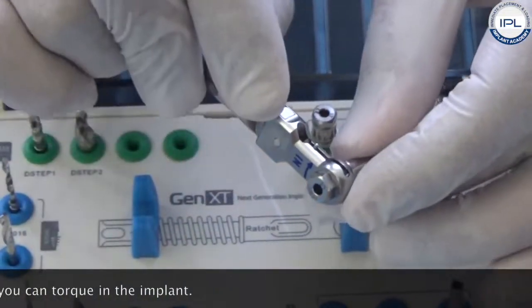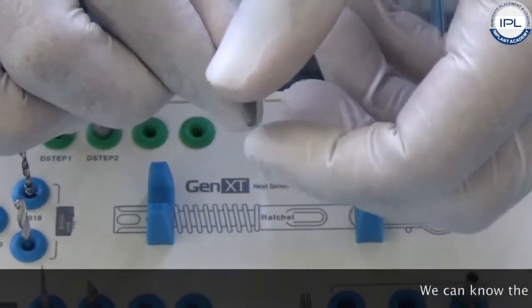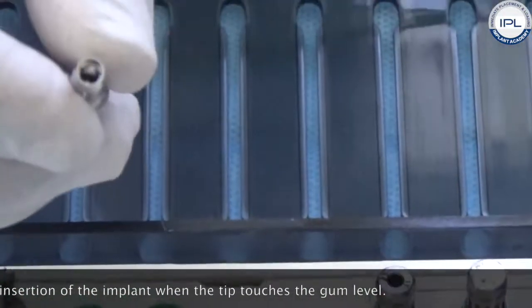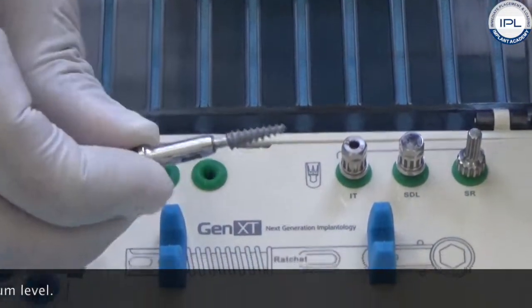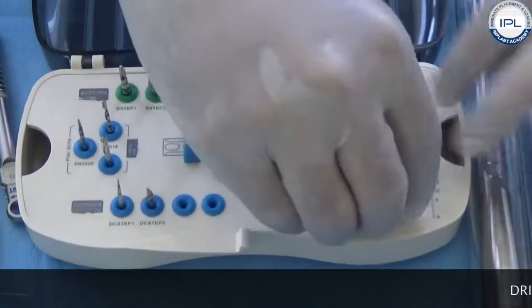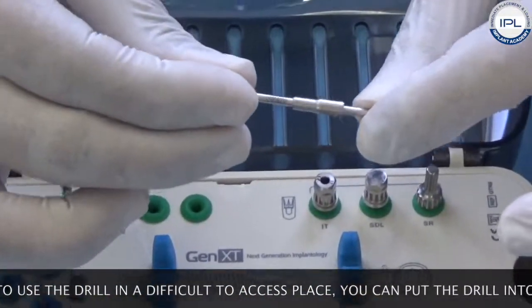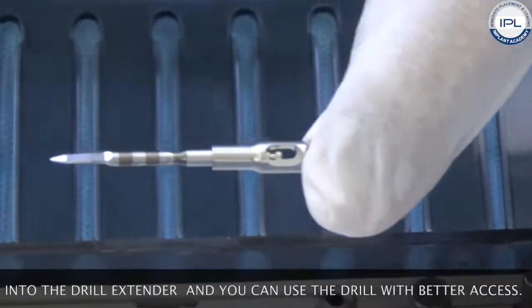A helpful guide for knowing the complete insertion of the implant is when the tip of the insertion tool touches the gum level — that tells you the implant is completely inserted. We also have a drill extender: if adjacent teeth are hindering access or you need to use the drill in a difficult area, you put the drill into the drill extender, this part goes into the handpiece, and you can use the drill with better access.